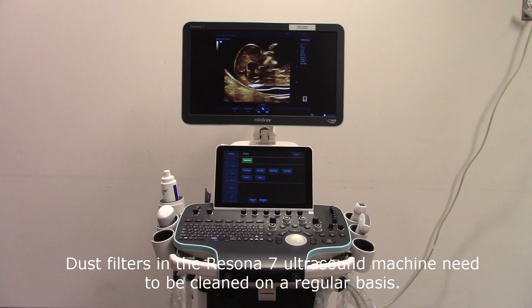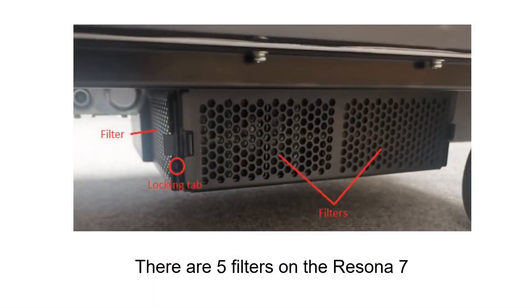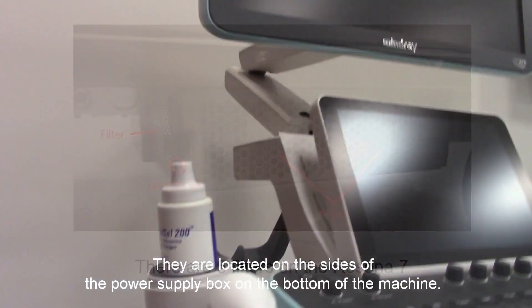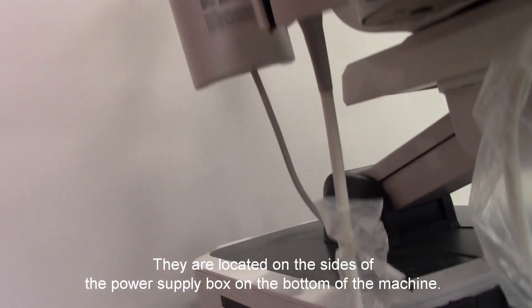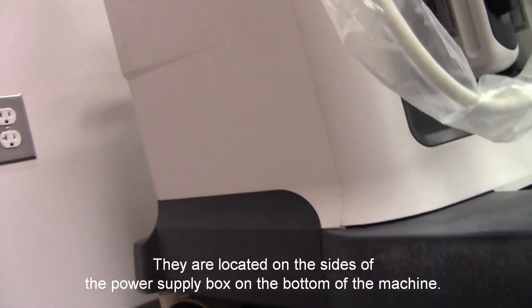Dust filters in the Resona 7 need to be cleaned on a regular basis. There are five filters on the Resona 7, located on the sides of the power supply box and on the bottom of the machine.